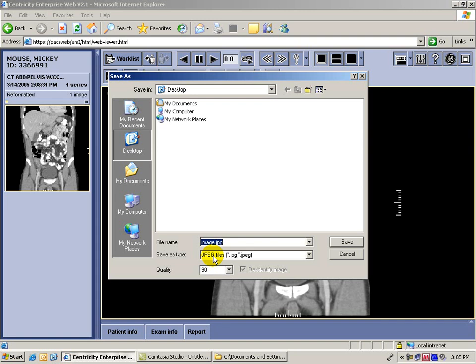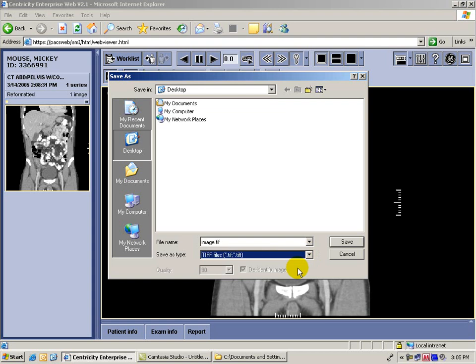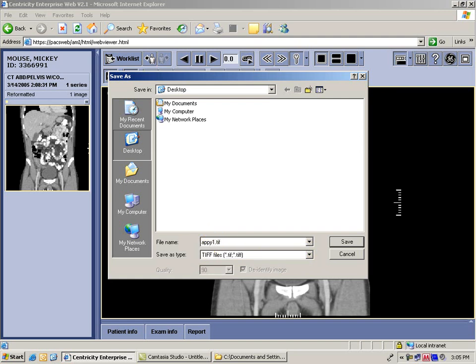When you're doing an image for publication, you want to make sure that you use lossless compression. So what you do is go down to a TIFF file and save it as a .tiff. Then you want to name your file something you'll remember — in this case, I'm going to call it 'appy1' so that I'll remember that it's my appendicitis case.